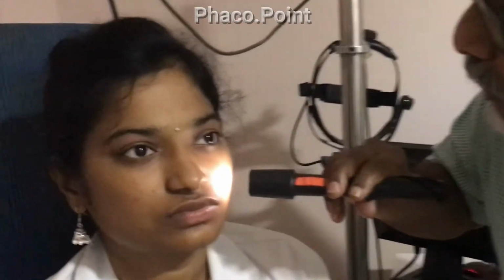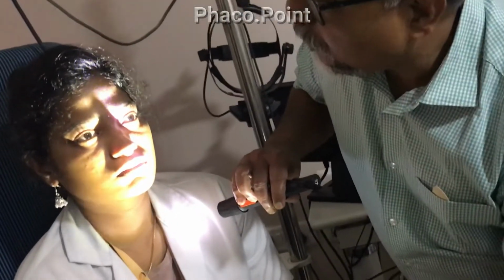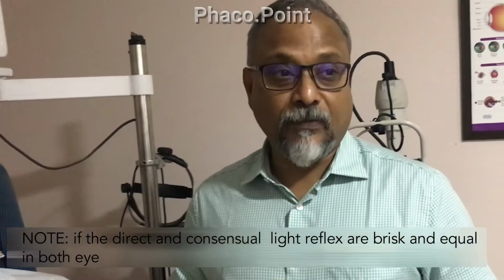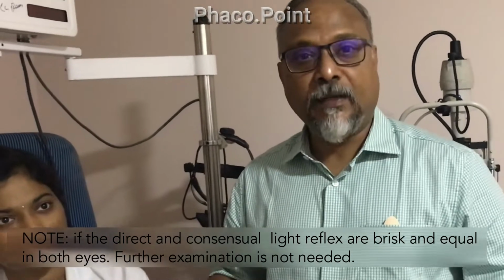So once you are there, I'm running through the same procedure again. The torchlight falls on the pupil and you look at the pupillary reaction, and then the consensual light reflex. You bounce the light off the patient's nose and chin, so both pupils are illuminated. Shine the light on this eye and look for the pupillary reaction in the right eye. Now if the direct and the consensual reflex are brisk in both eyes, then we don't have to check further. That means both pupils are reacting briskly.